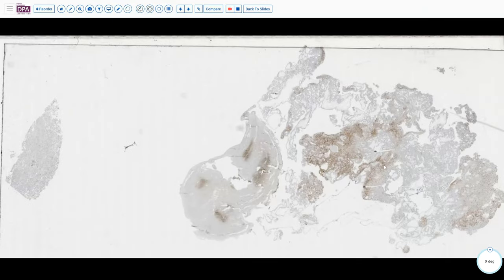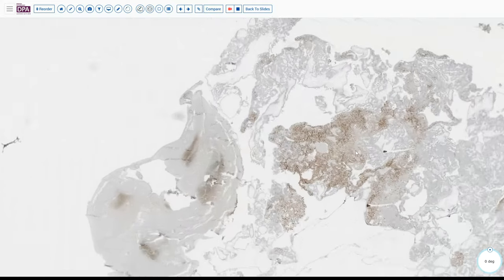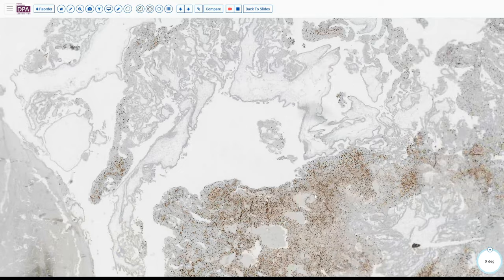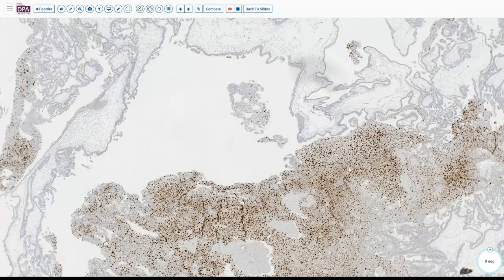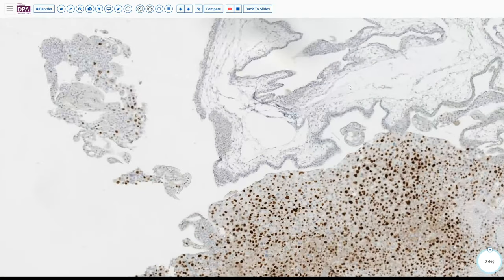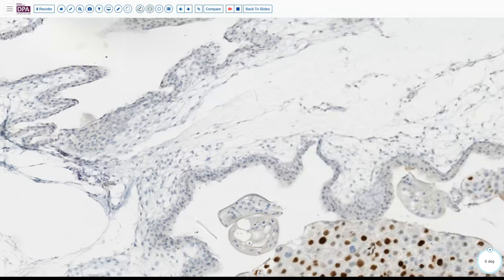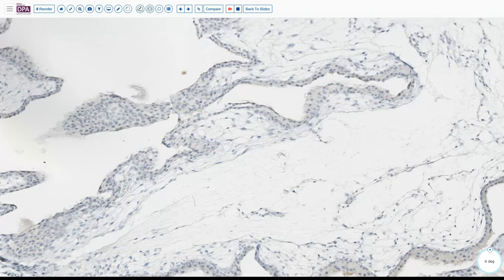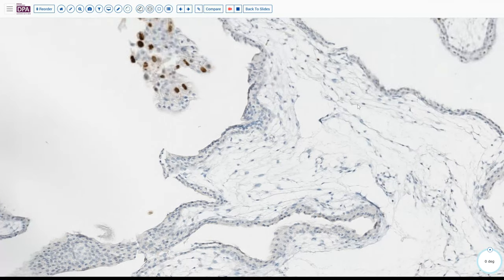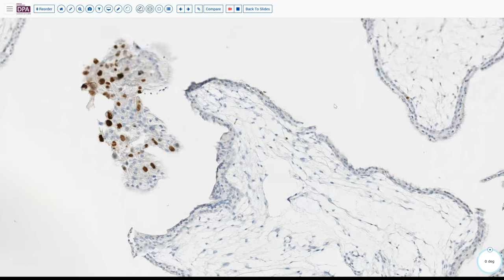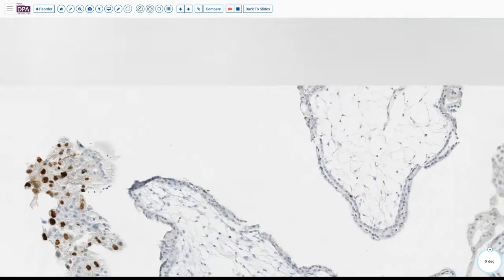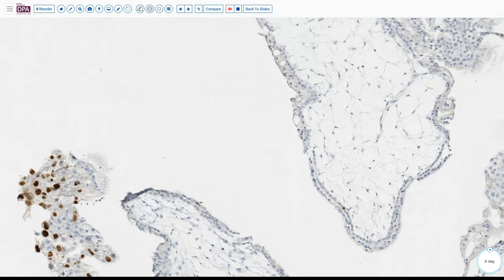So let's look at the p57 from our particular case. We can see expression in decidua — so that's not what we're concerned about. We see expression in the decidual tissue, but we want to look at what's going on in the villi and in the trophoblastic tissue surrounding the villi. And as we see here, there is no expression. Pieces of decidua, implantation site, and so forth can have it, but pretty much no expression in the villi. A rare cell — I don't think we're going to call that positive expression, because this should be in most or many of the nuclei. So our particular case is absent expression, and therefore a complete mole.